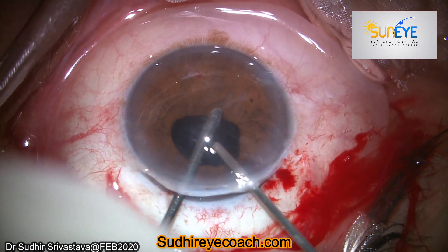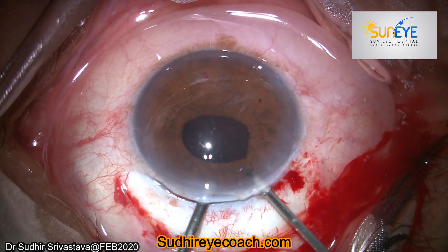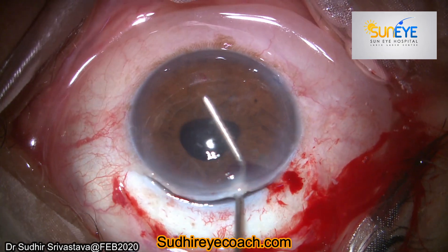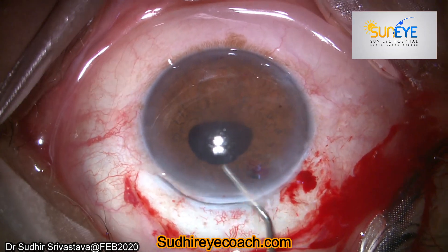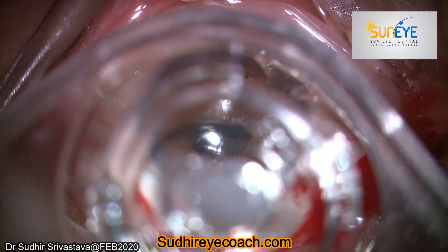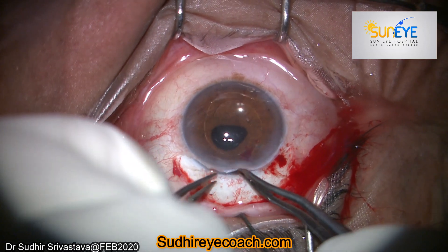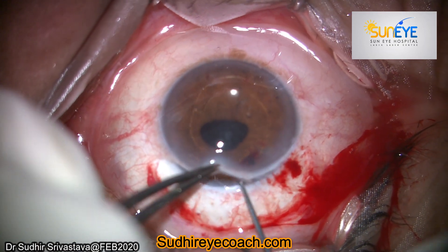While doing the anterior vitrectomy, I was thinking about which IOL to implant — whether I should go for an AC IOL, an iris claw lens, scleral fixation, or a glued IOL. I made a small peripheral iridectomy, then filled the chamber with viscoelastic and checked whether the vitreous was clear from the anterior chamber. Finally I decided to implant an anterior chamber IOL.